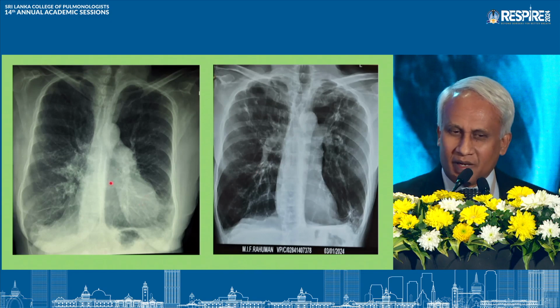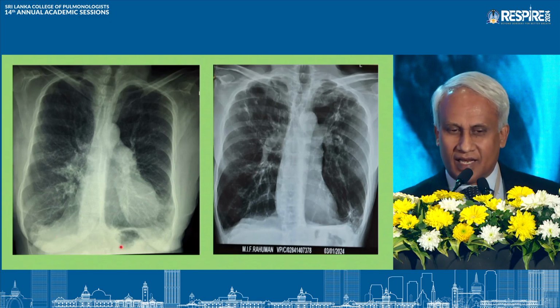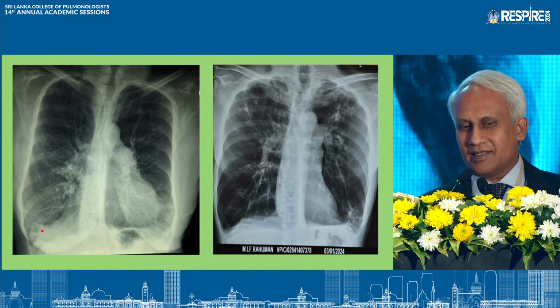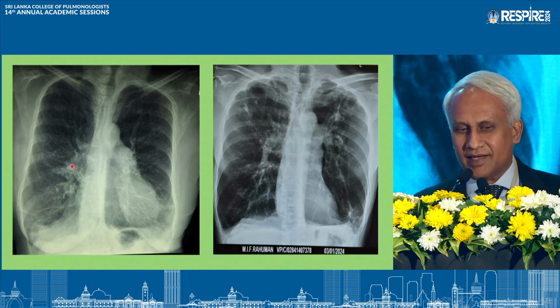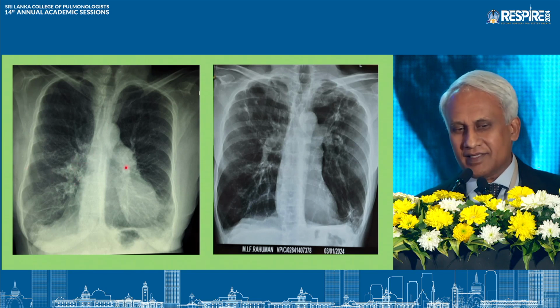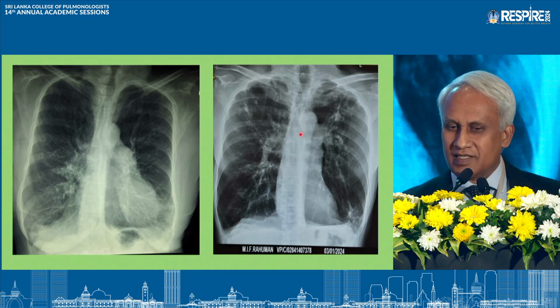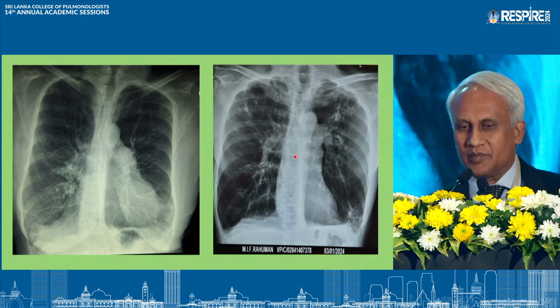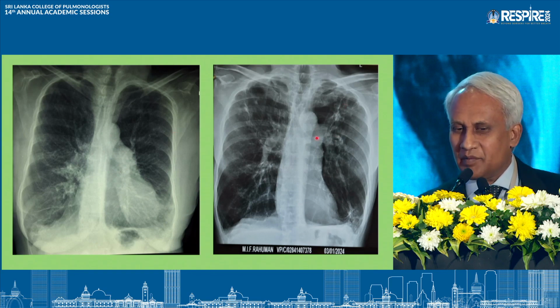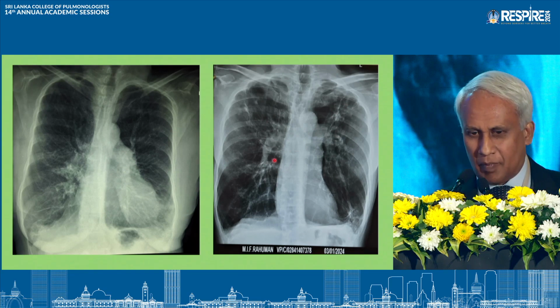Now look at the pulmonary arteries. In this patient, you can see hyperinflated lungs with flat diaphragms, and it's a rotated film. You can see right pulmonary vessels prominently, and this is the main pulmonary artery. And in this X-ray, it's a post-TB patient. You can see both hilum moving up due to fibrosis and prominent hilar vessels. So think of pulmonary hypertension then.